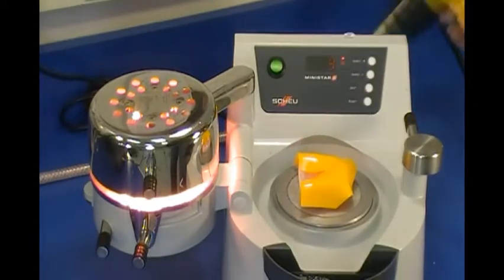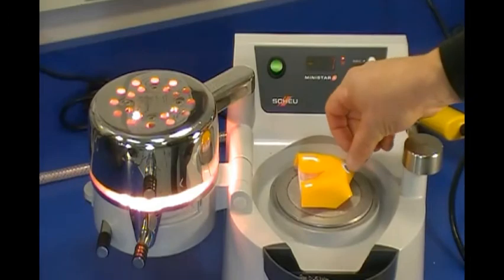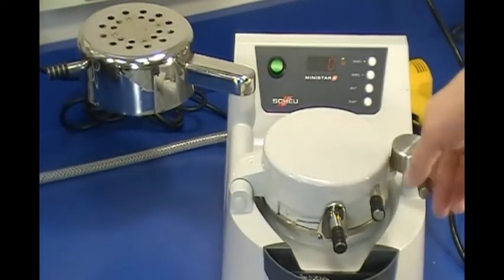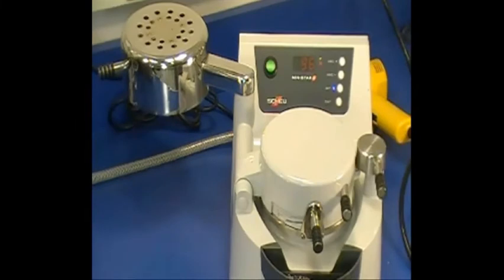A decal or patient name can be placed on the colored material along the incisal region. At the end of the timed heating cycle, remove the lamp from the material and swing the chamber over the model on the platform. Engage the locking handle to start the molding and cooling process.